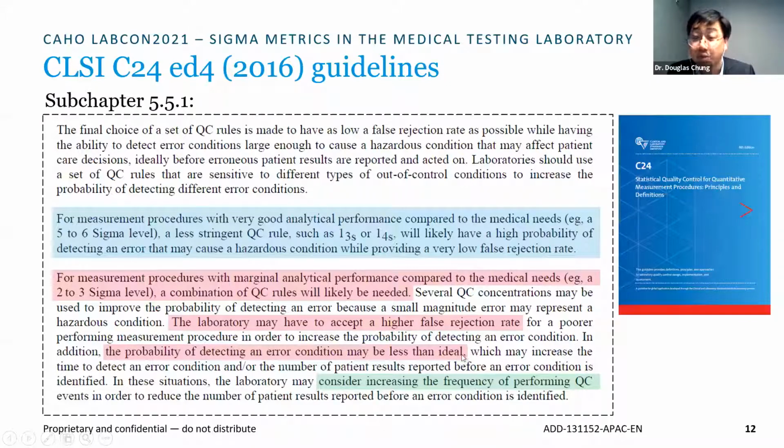That means higher risk for the patients. And thirdly, this is a very interesting point, so please remember this, right? You may also need to consider increasing the frequency of performing QC as well. And I put this in a different color because we'll come back to this a little bit later on.